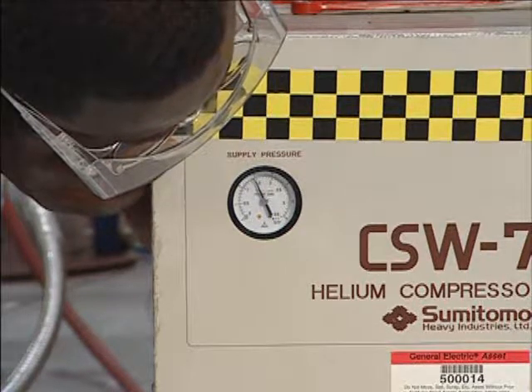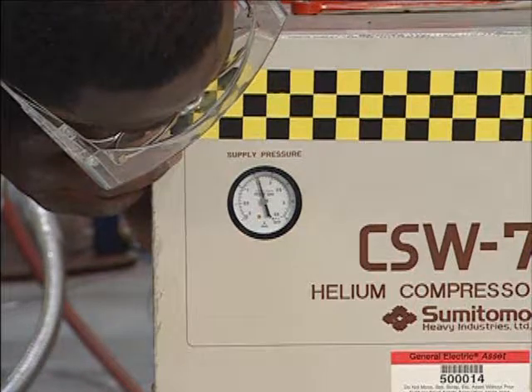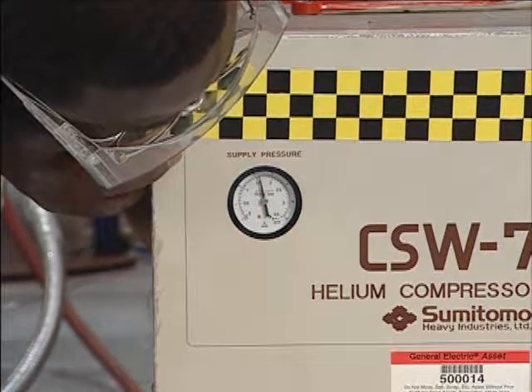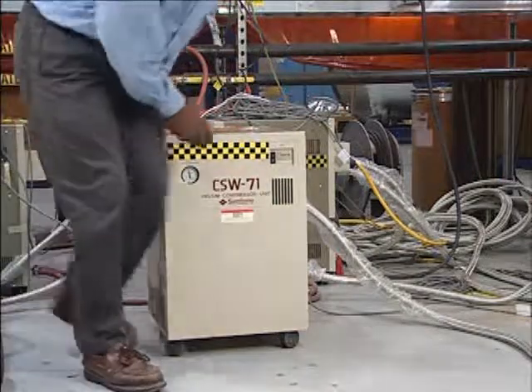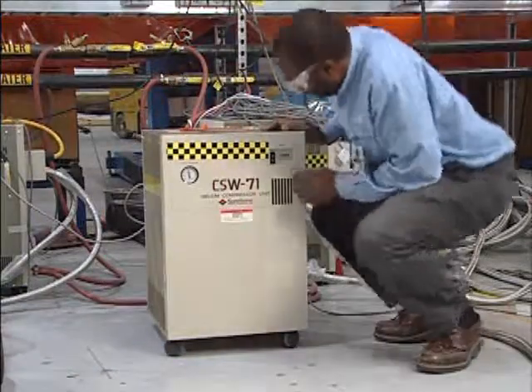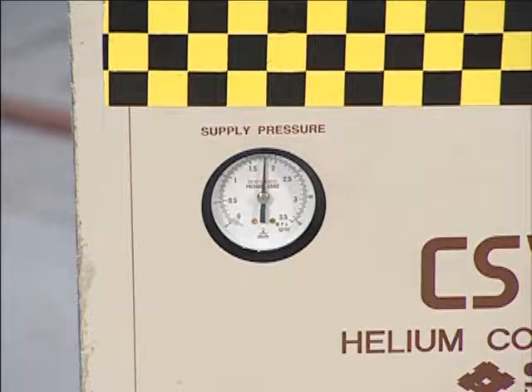Charge the compressor to a value in the mid-range of the spec. When complete, turn off the charging valve. Restore power to the compressor. Inspect the helium pressure gauge and make sure that it is now operating within specification.